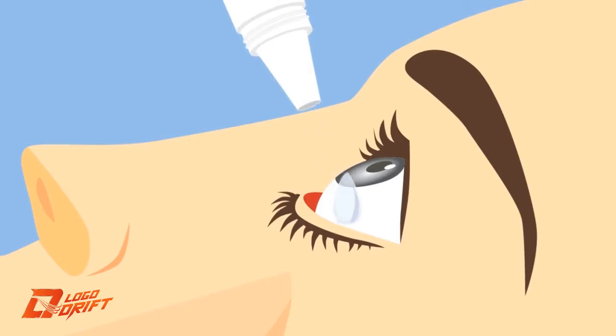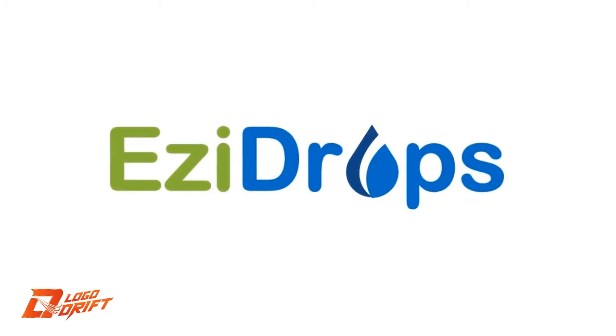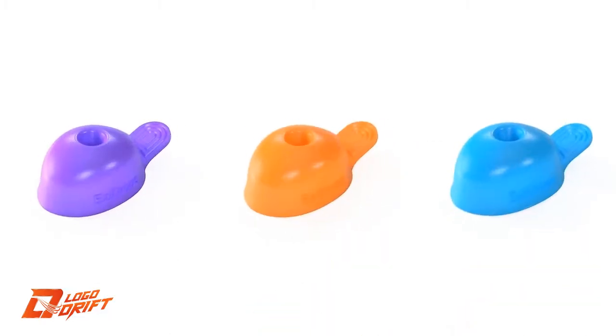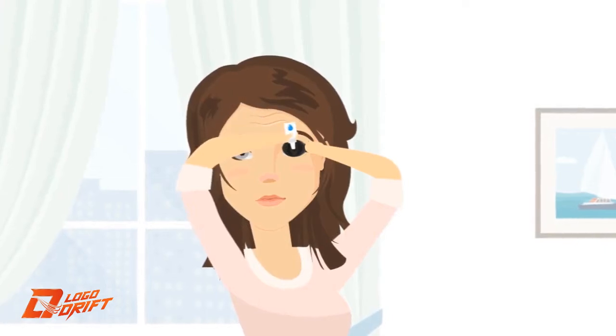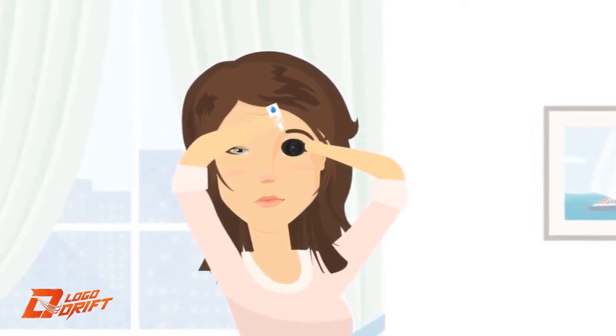Are you struggling putting your eye drops into your eyes, always finding that the drops never land directly in the eye and you keep missing? We have the perfect solution. Easy Drops is a simple to use eye care applicator that helps you put eye drops into your eyes first time every time, right into the center of your eye.